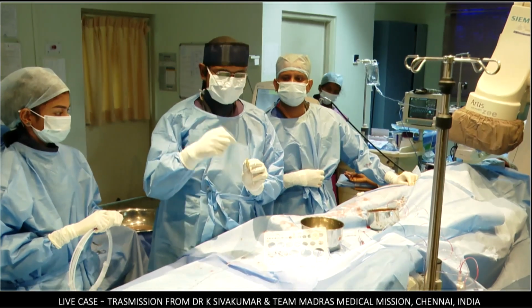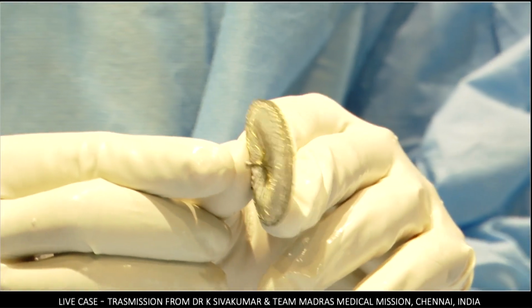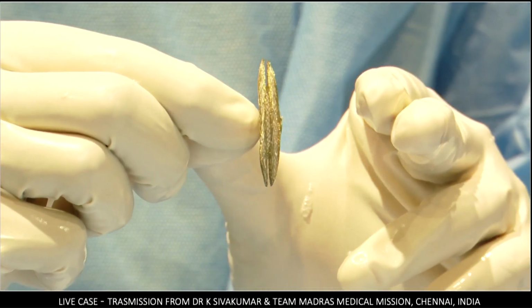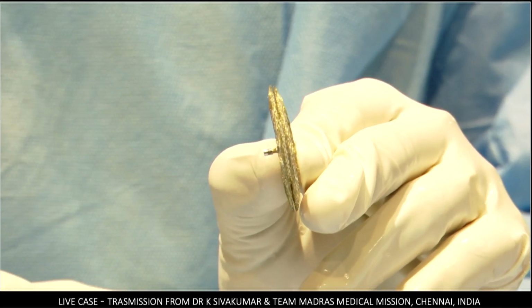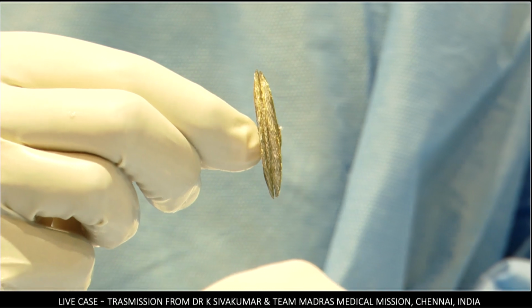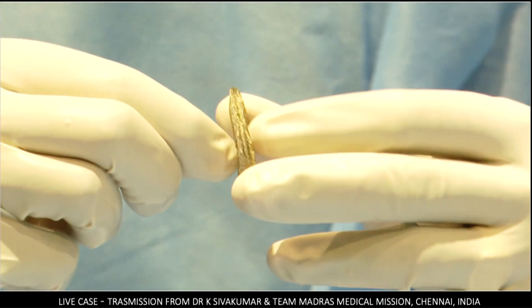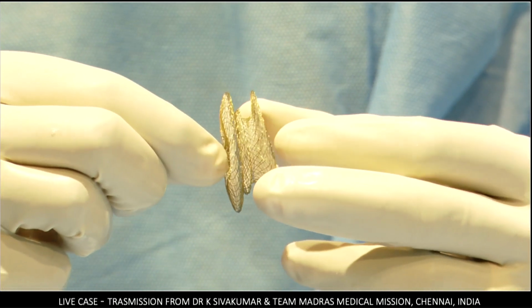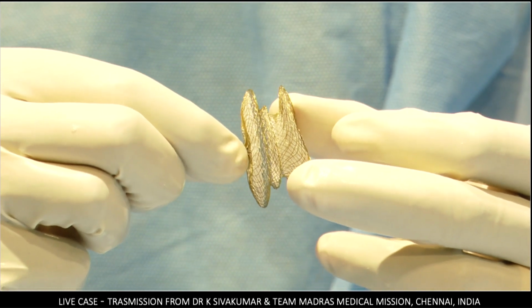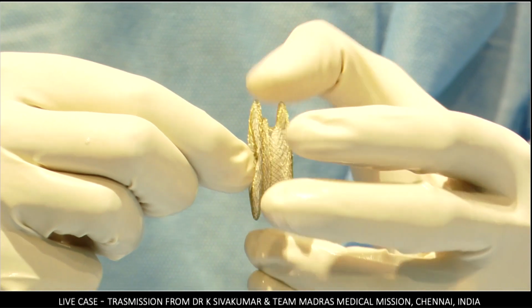I will tell you the features of this device. Number one, the screw end is a little longer, which makes it easier to grasp if there is a possibility of embolization. Number two, it has equal left atrium and right atrium discs, more like some of these cribriform devices. Number three, it has a differential waist. If I spread it out, we can appreciate that what is closer to my finger, that is closing the screw, I will just separate it out.